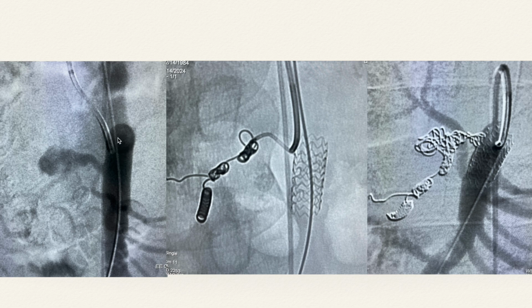So this is a case of SMA pseudoaneurysm. This is the SMA, this is the SIM1 engaging the SMA, and in the proximal SMA there is a small pseudoaneurysm arising from the inferior pancreaticoduodenal artery. So here the best option is coiling. You go distal, you coil from here, then you coil at the neck, and you coil it proximally also. But the problem is the stability of the main catheter and microcatheter, because here it's 90°. So for good stability, you would deploy a stent first, and a stent assisted coiling will be done.